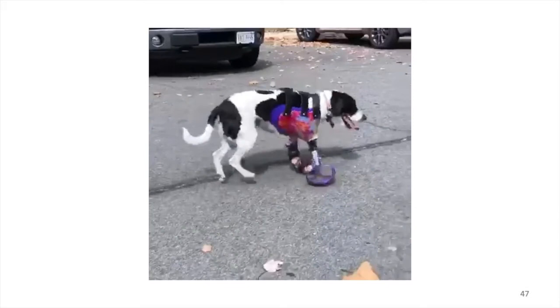All right, so you could see then that it's come a long way. Everything from the actual cast mold, which was able to be created around this patient's body, they were able to then use a software to scan that. Then they were able to take that, input it into 3D modeling or 3D rendering to get the final material that was 3D printed. And because of that, it fits absolutely perfect to the mold, which fits absolutely perfect to the patient. So it now appears that we can do this with 3D modeling, get them extremely accurate.